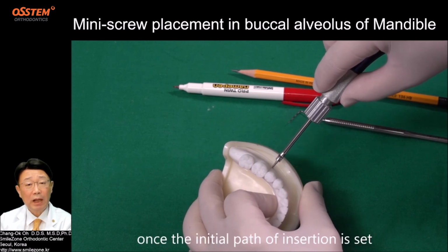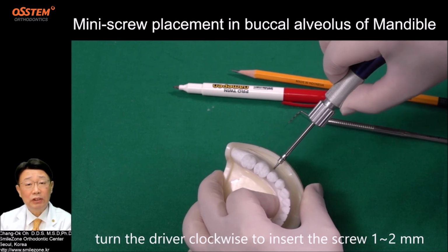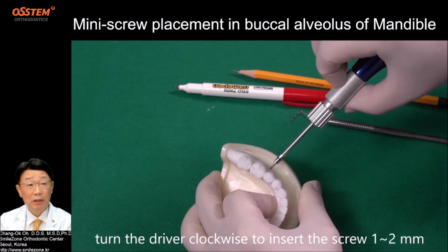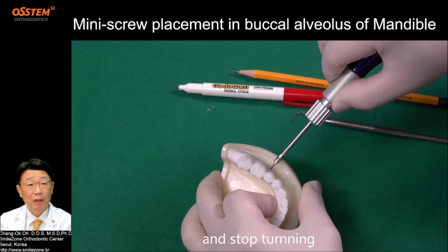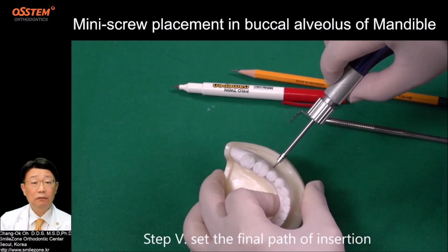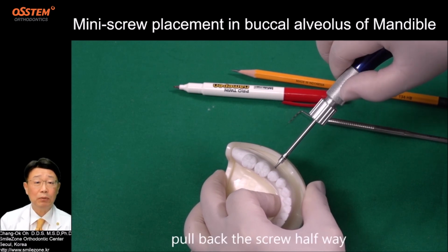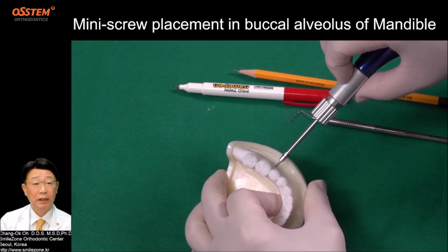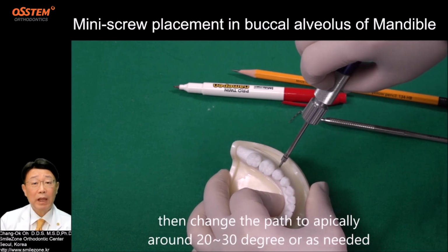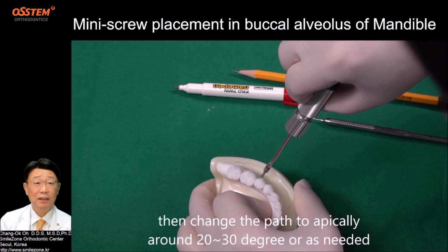Once the initial path of insertion is set, turn the driver clockwise to insert the screw 1 or 2 millimeters. Step 5. Set the final path of insertion. Then by reverse turn, counterclockwise, pull back the screw halfway. Then change the path to apically, around 20 to 30 degrees or as needed.